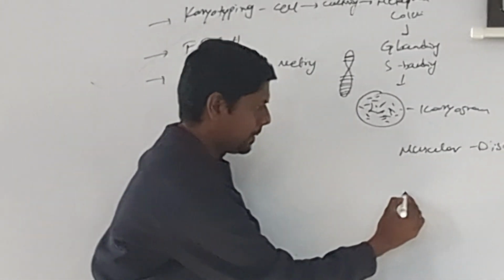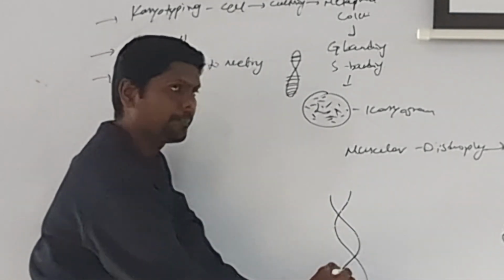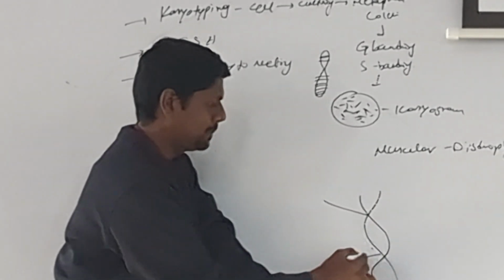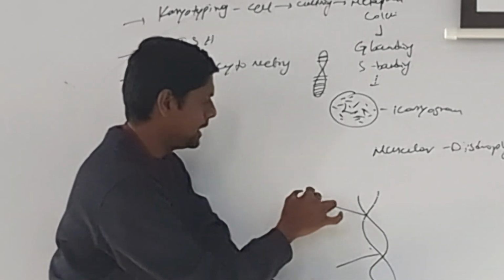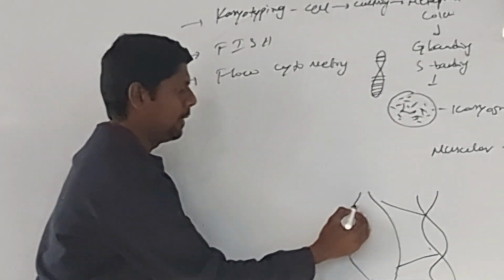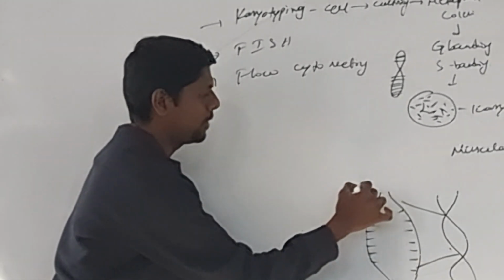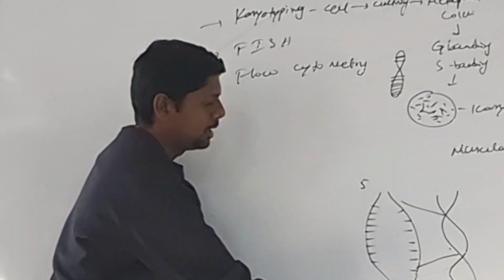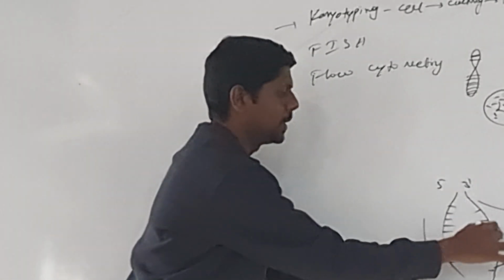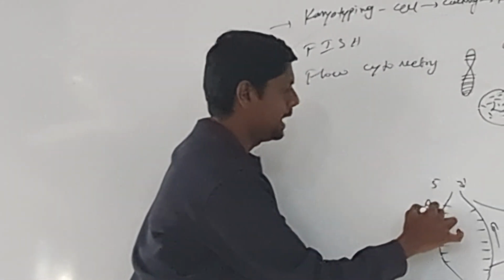now see, I have taken a piece of DNA and I have unwound this portion. This portion has been unwound like this. DNA has complementary base pairs, 5' to 3', 5' to 3'. This is the gene, let us assume, and it has base pairs.